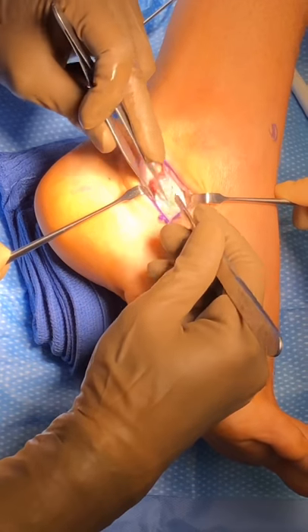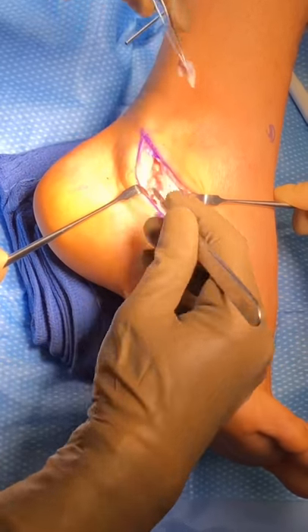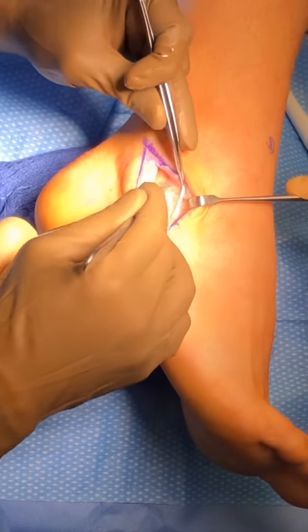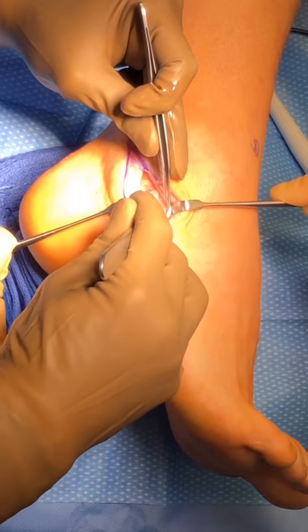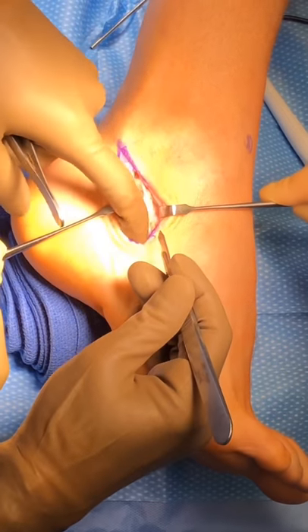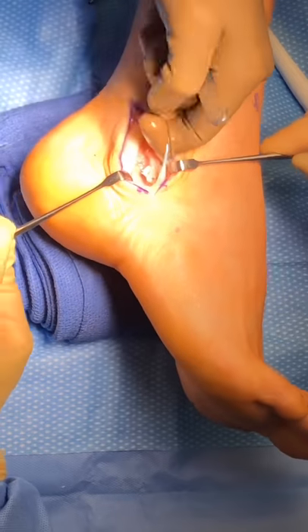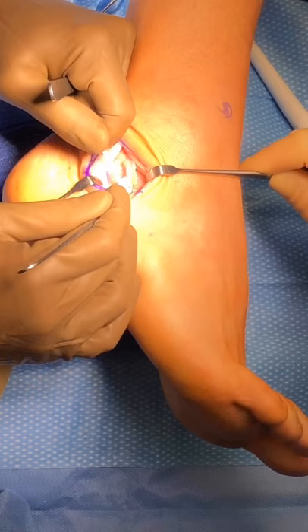Another thing that's very common to high arch patients is what we call an enlarged peroneal tubercle, which is this big old hump of bone. And that can be painful, so we'll remove that enlarged peroneal tubercle as well. And here's a tear of that longus, so we'll go ahead and cut that out now.